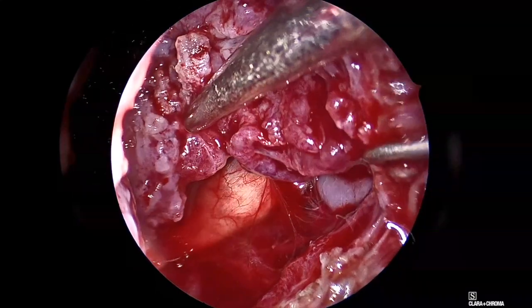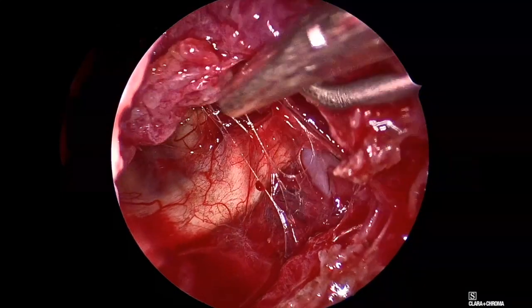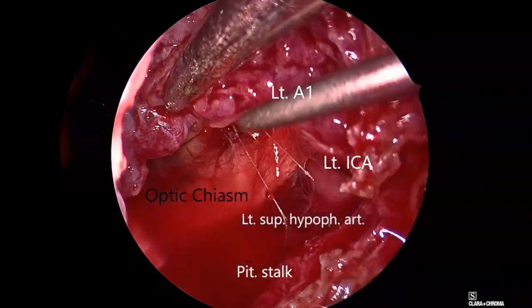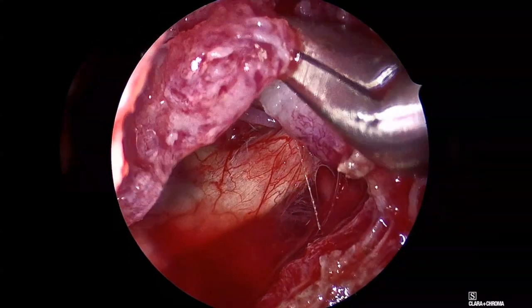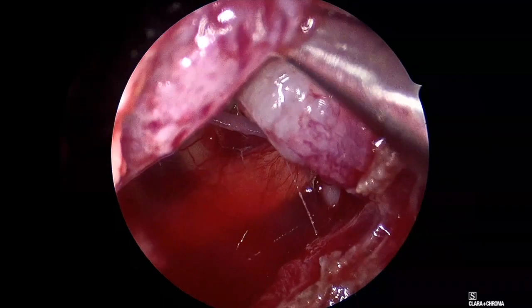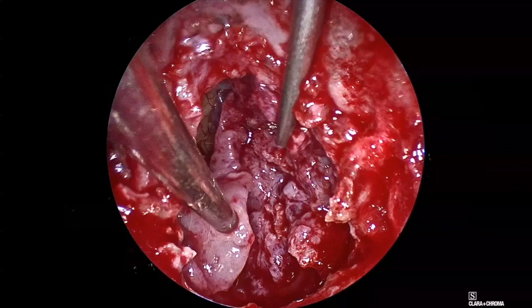Dissection was the most prolonged phase of the surgery and was carried out patiently with micro-rolling maneuvers, keeping the arachnoid layer over the vessels intact, and bit by bit tumor removal, progressively making the tumor smaller and smaller.